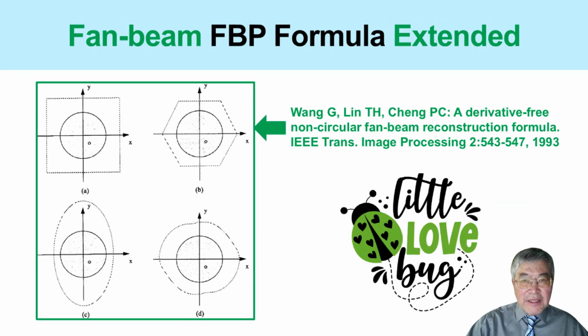This heuristic explanation is not only interesting, it also gives us a way to extend the fan beam formula beyond the standard circular scanning trajectory. In the textbook derivation, the fan beam formula is usually derived under the assumption that the X-ray source moves along a perfect circle. That means the radius is constant. But think about the arguments we have just used. The detector obliqueness is a local view-by-view effect. Beam divergence is also a local effect. The angular conversion is also based on the local geometry at each view.